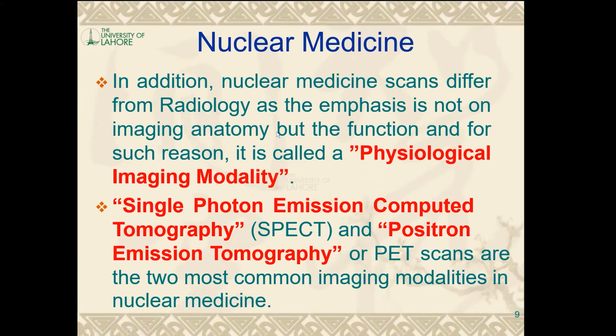The two most common devices which use the physiological imaging modality of nuclear medicine are the SPECT scan and the PET scan. SPECT scan means single photon emission computed tomography, while PET scan means positron emission tomography. These are the two most common imaging modalities in nuclear medicine.